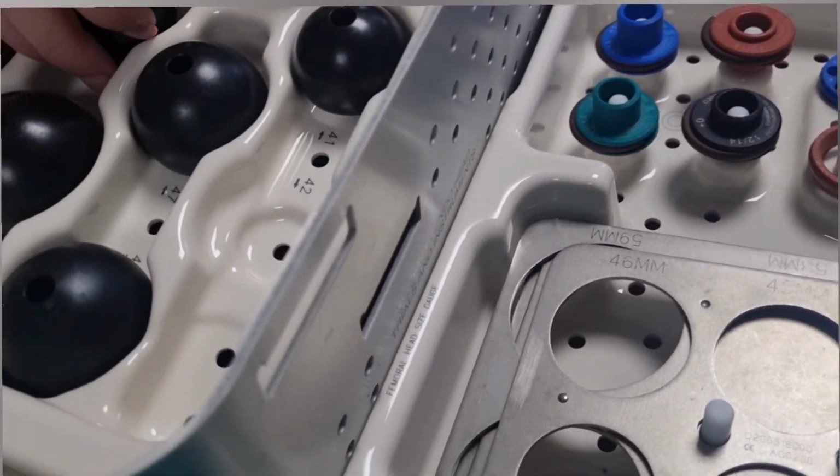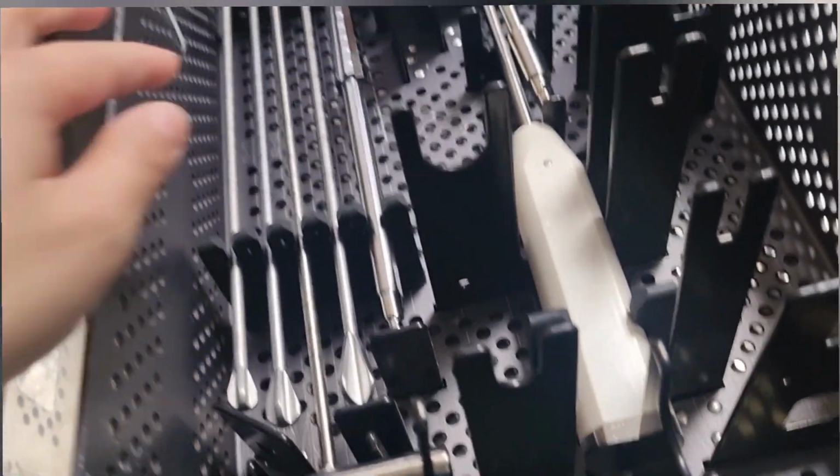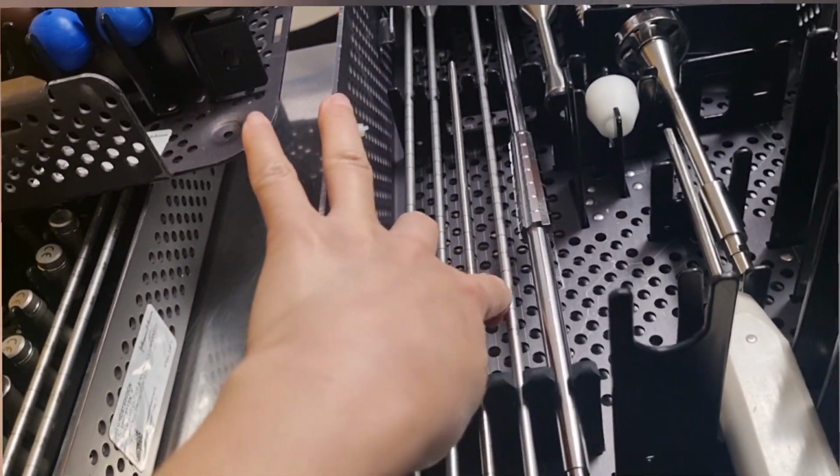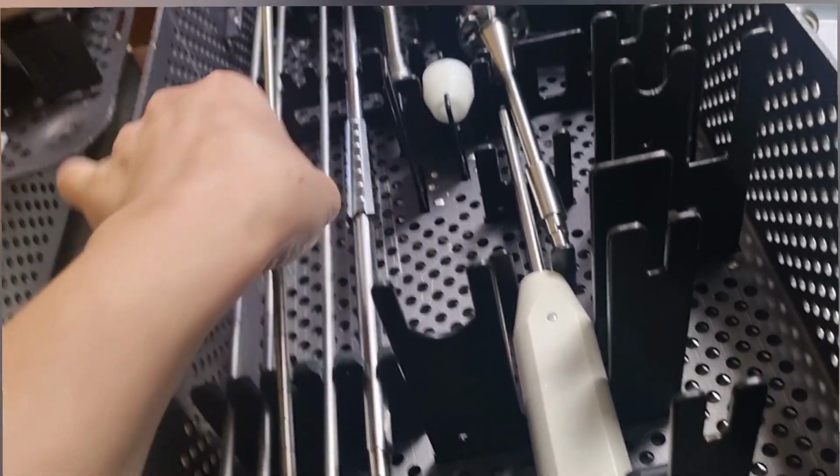So with the C-stem, that's basically it. Done. And then they said that this is the sizer for the centralizer. Perfect. And what is this one? What is this one for?